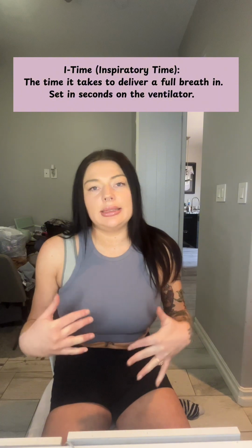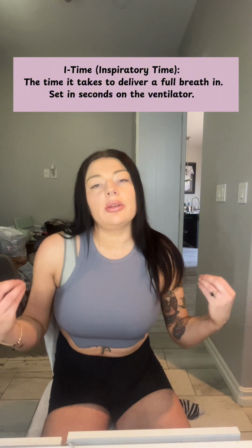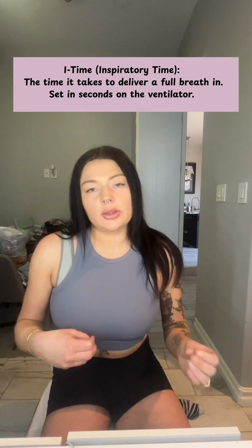I time is the duration of inhalation in a single breath. This is set directly in pressure modes or derived from flow and volume in volume control modes. It also controls how long the lungs are inflated before the exhalation process begins. Typically, if your I time is too short, you're going to have oxygenation issues, and if it's too long, you're going to have retention.